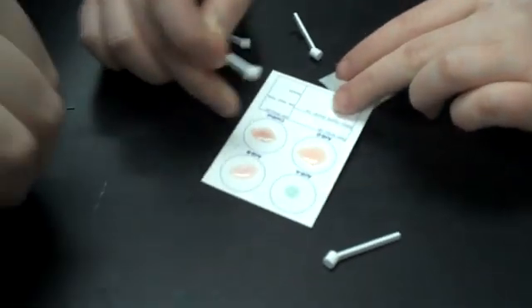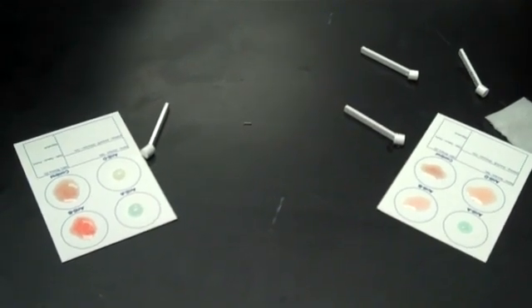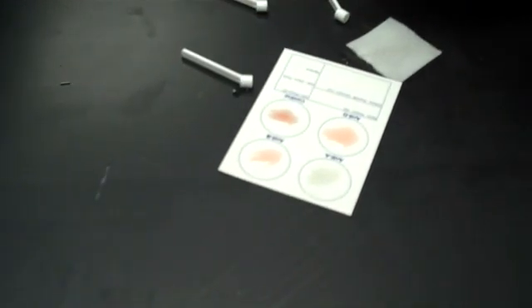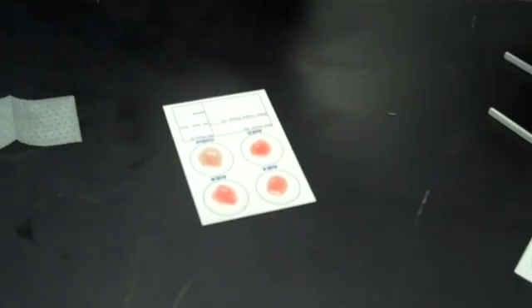You kind of have to move fast, otherwise your blood starts to coagulate. Hopefully you know what coagulate means — it thickens, or the fibrinogen breaks down to fibrin and it starts to clot. Now pick up the card and rotate it back and forth to keep the blood from coagulating on its own. You want a reaction to occur with the antibodies on the card.